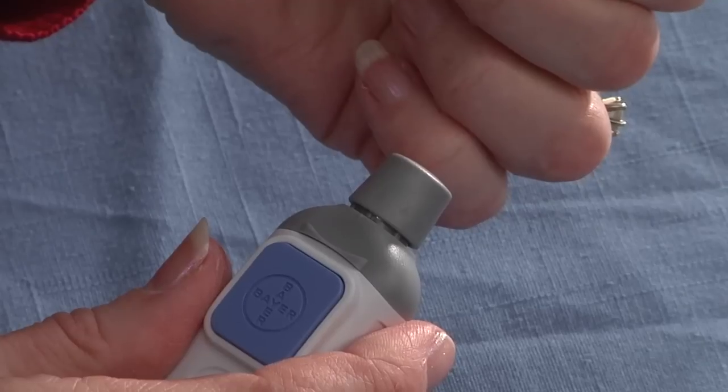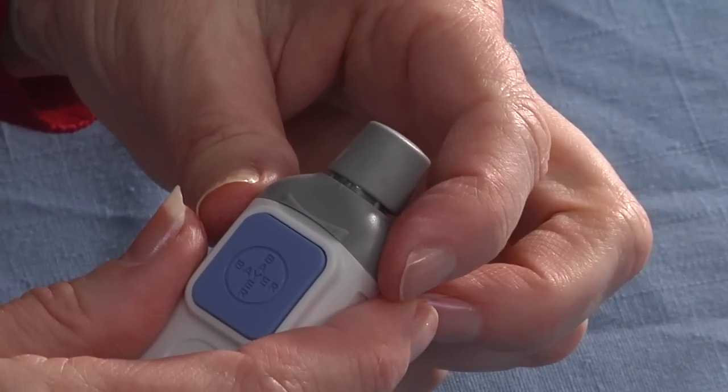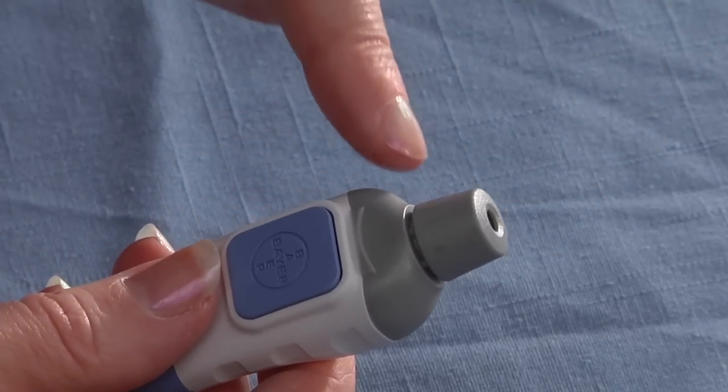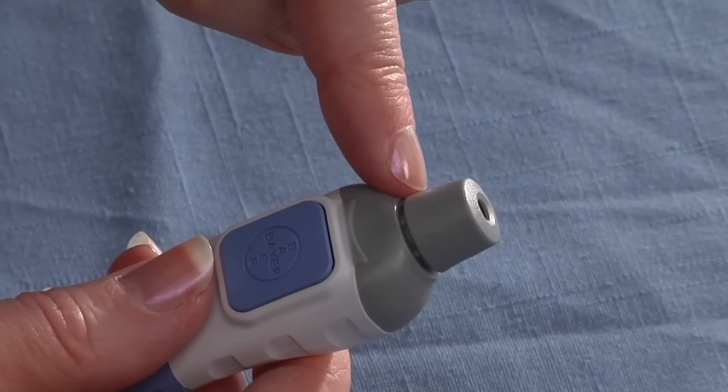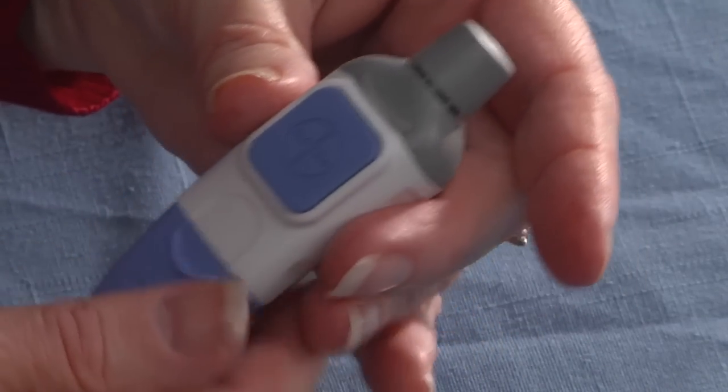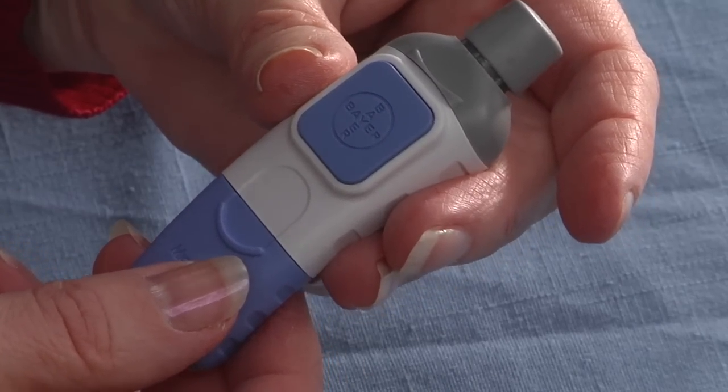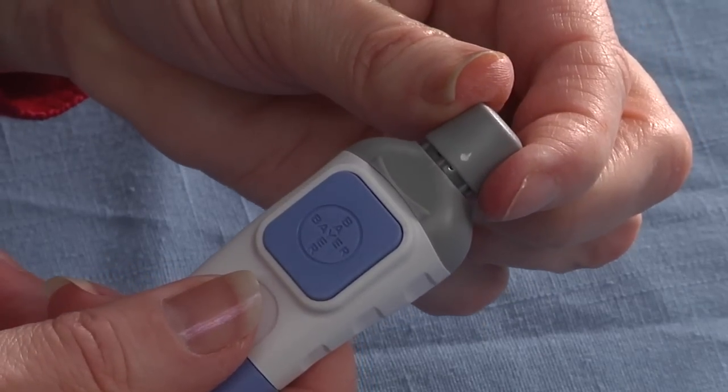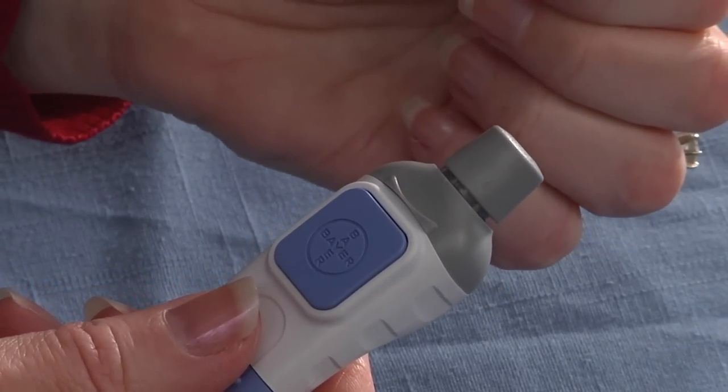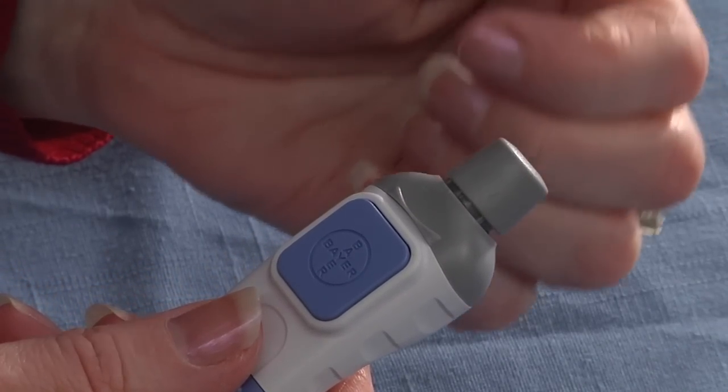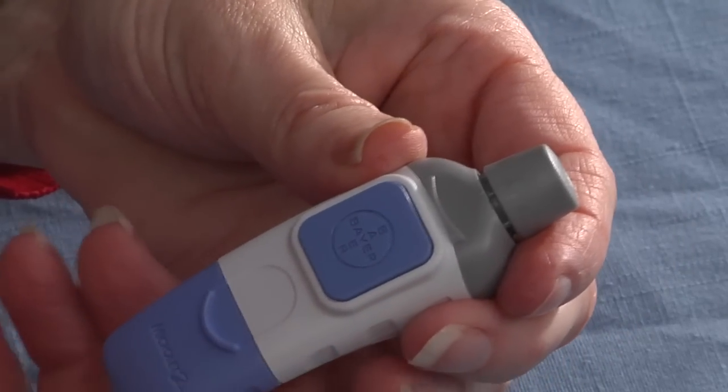The cap has different sizes of drops. Most lancet holders will either have dots or drops, or sometimes they're down here, or numbers. The larger the dot, number, or drop, the deeper that needle will go into your finger. So you want to turn this down to the lowest setting possible and still get a good drop of blood.